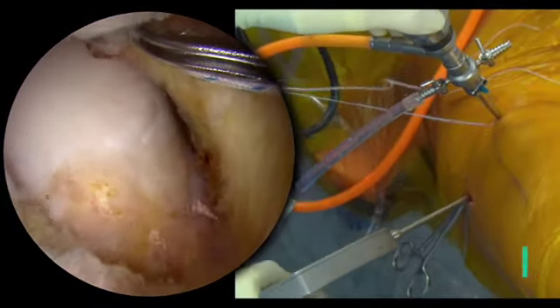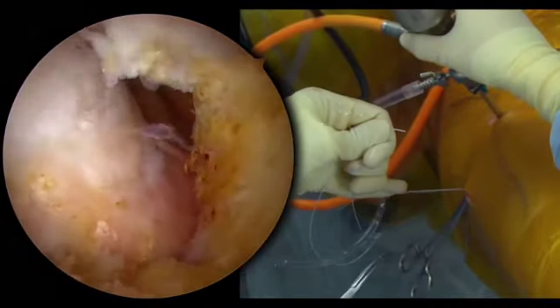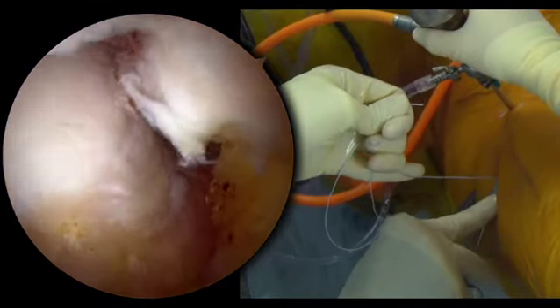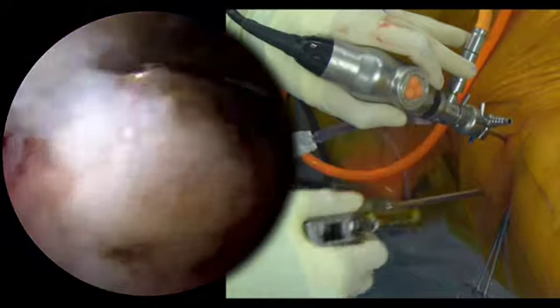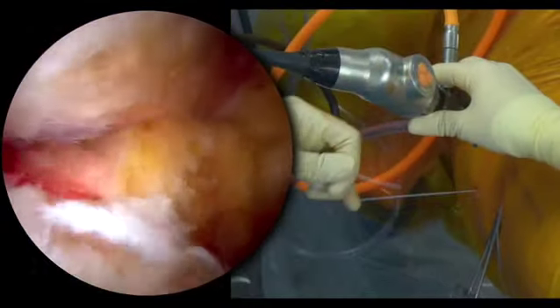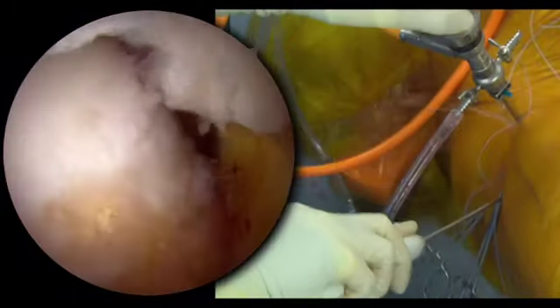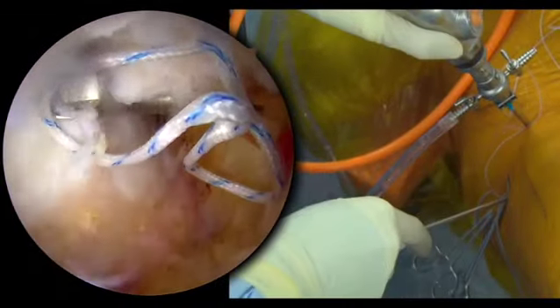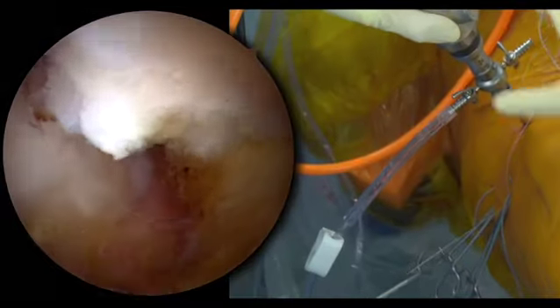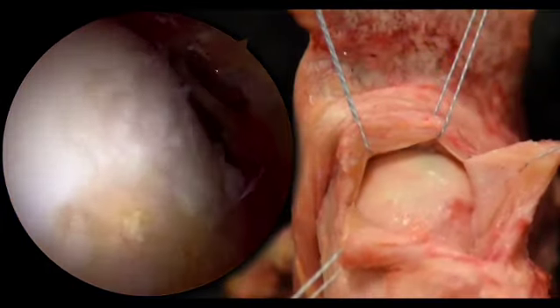Multiple sutures are passed with the use of a suture passer to place traction stitches and allow for improved visualization of the hip. By this time, 2 traction stitches had been previously positioned during the central compartment portion of the scope, while an additional 2 are placed in the medial and lateral leaflets created upon extension of the T portion of the capsulotomy. Representation of the final positioning of the traction stitches is shown.